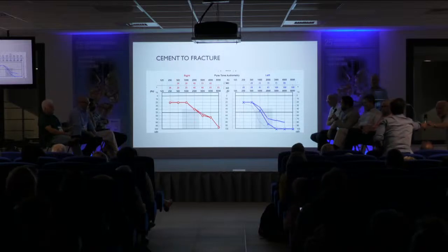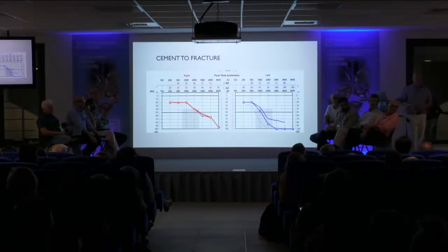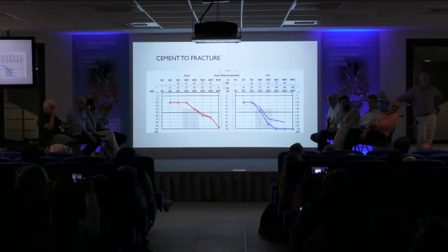Okay, all right. Chris, what I did in this case, because I had several cases of trauma like this, is I used the malleus replacement prosthesis, the one you saw in my YouTube channel. So I put the MRP and put a TORP at the same time, or stage the placement of a TORP. But that's exactly what I do.